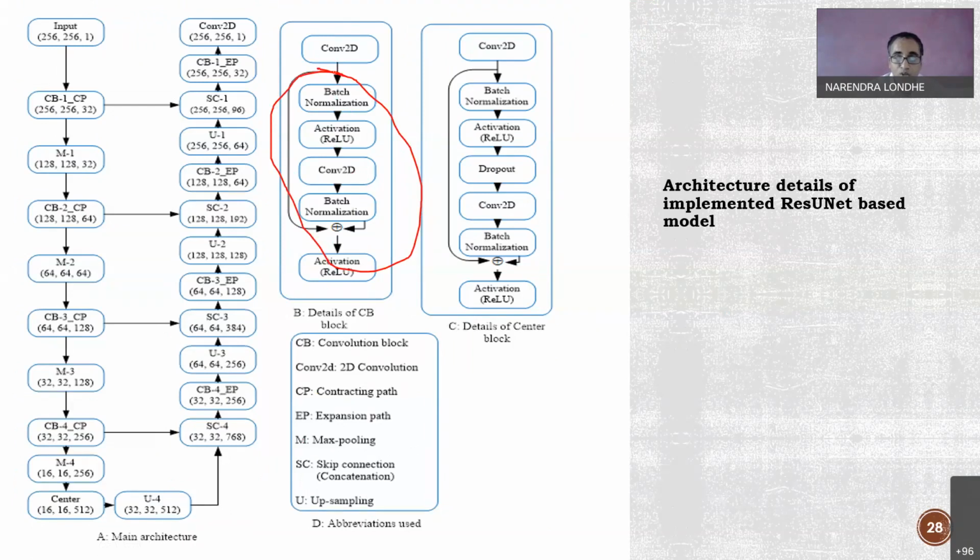It means after the 2D convolution, I'll be taking these features, and these features will also flow through this path, and the features from my earlier path, this residue, will be added to my current features, and after that it will go to the activation function. So that is the difference. Residual in the sense the old features will also be taken as an input.